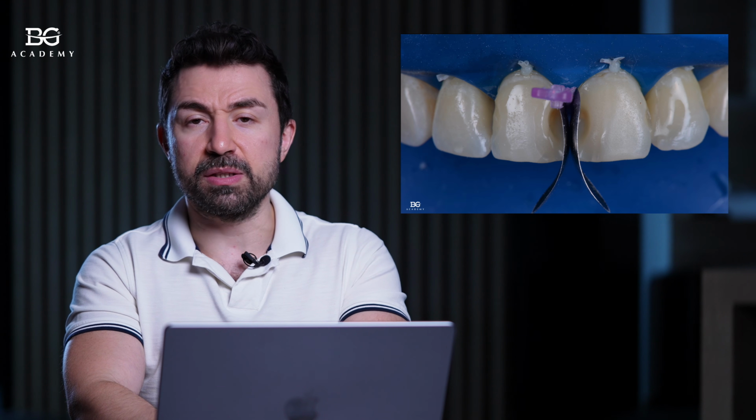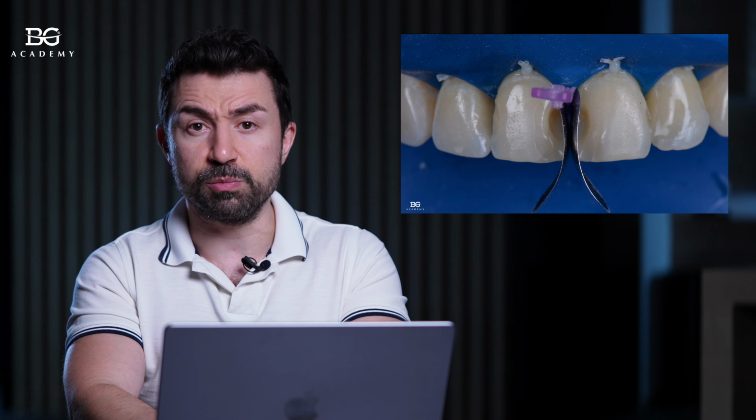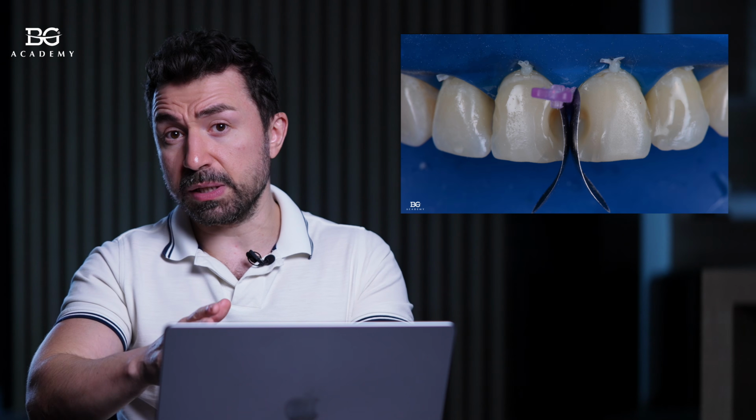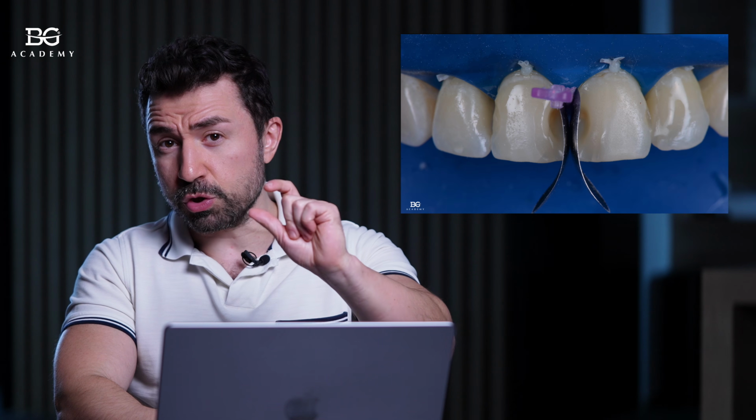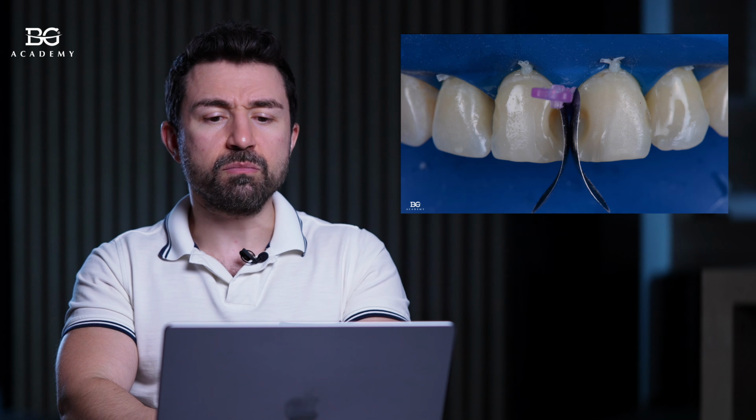But if speaking about the mesial profile, the profile itself has to be more straight. So basically, once we place composite there, we will pull the matrix a bit with our finger to make the profile straight.